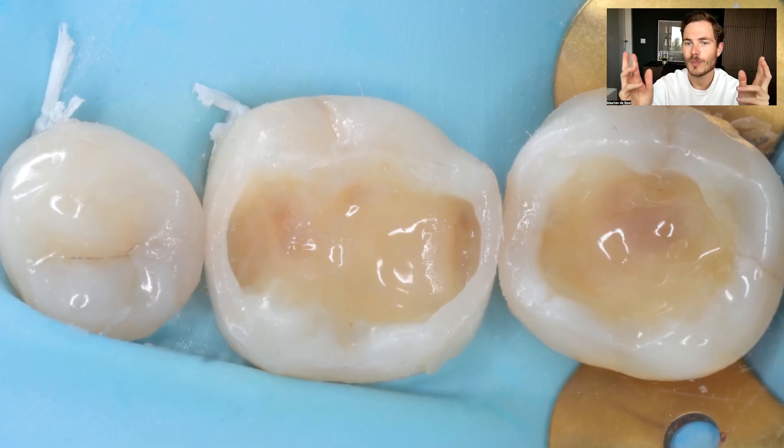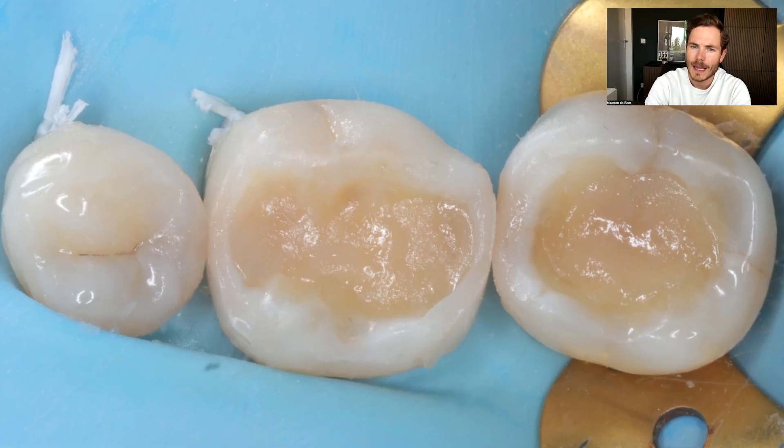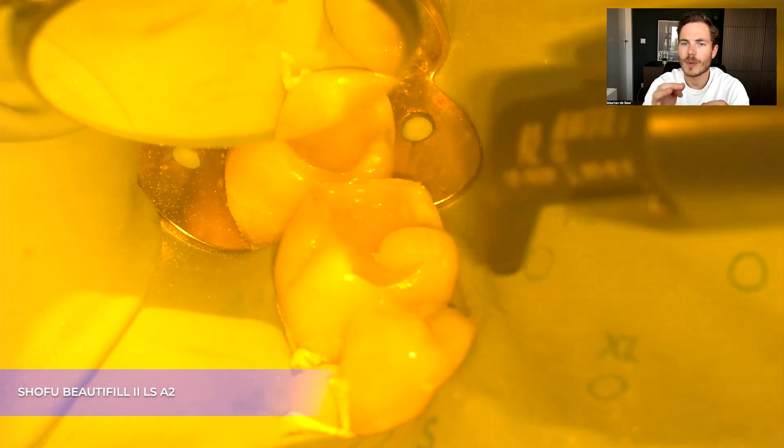Now we are back at two simple class ones and can follow all the references we have. I start with a thin layer on the occlusal part of the tooth just to level out the bottom of the preparation so that everything is at the same level, which makes my layering a lot easier. I did the same on the second molar, and usually I use a color A3.5 for this to get a little bit more depth in my restoration.